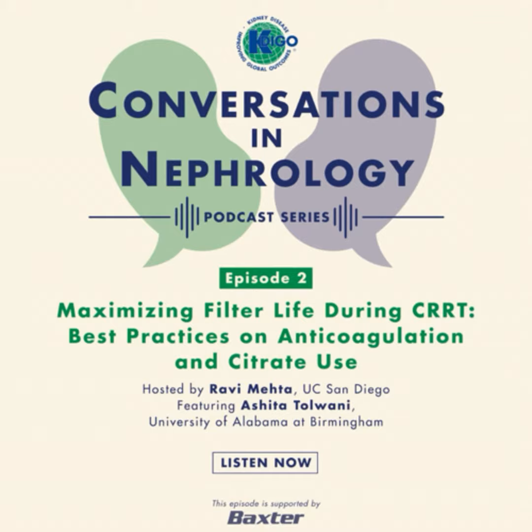Most of the time, when you're monitoring for citrate, most protocols monitor blood electrolytes, including the circuit and systemic ionized calciums, at least every 6 hours, or more frequently if there are changes made or if there's concern for accumulation of citrates. The bottom line is that in order to have a proper RCA protocol, you need a comprehensive algorithm of how to adjust the rates of the different components to prevent or correct for any of the acid-base abnormalities.